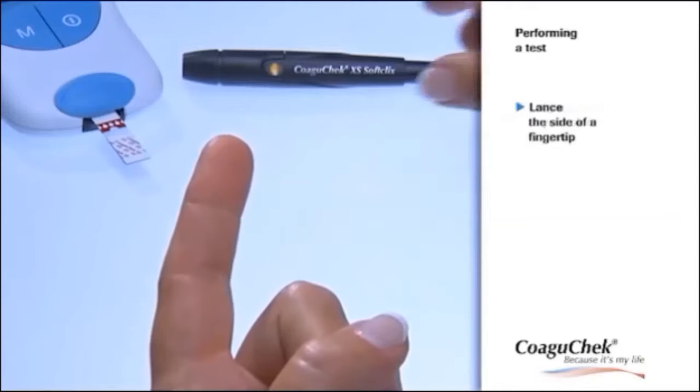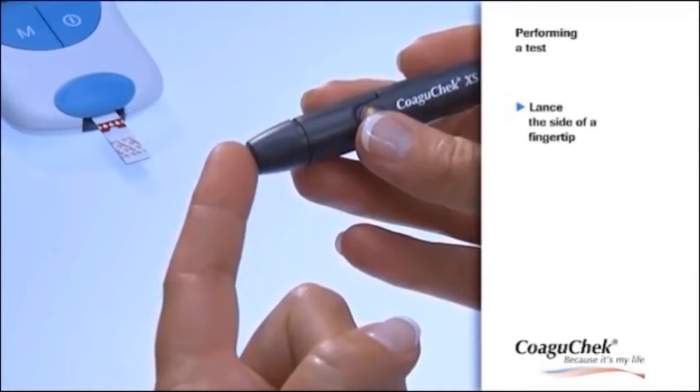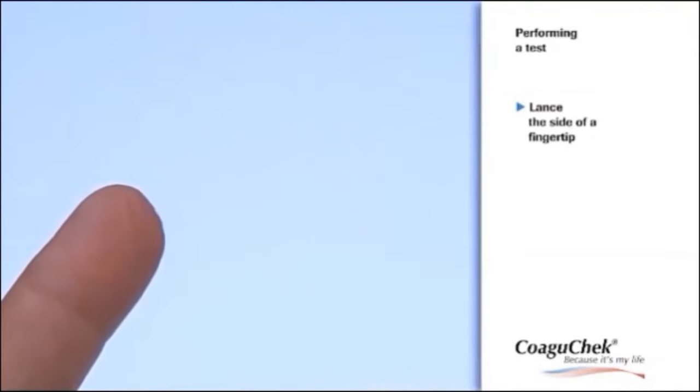Pick up the lancing device and lance the side of the fingertip. Don't worry. CoaguCheck SoftClicks allows a virtually pain-free blood puncture.